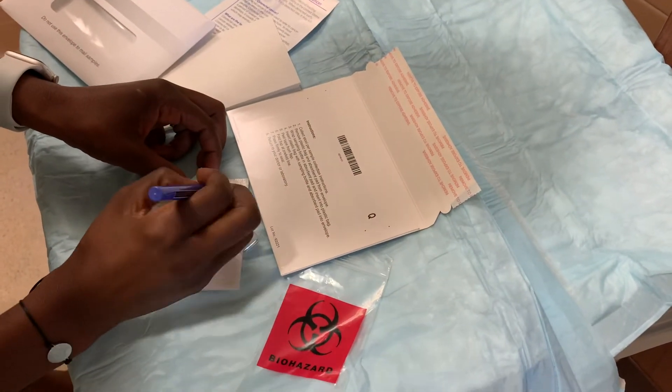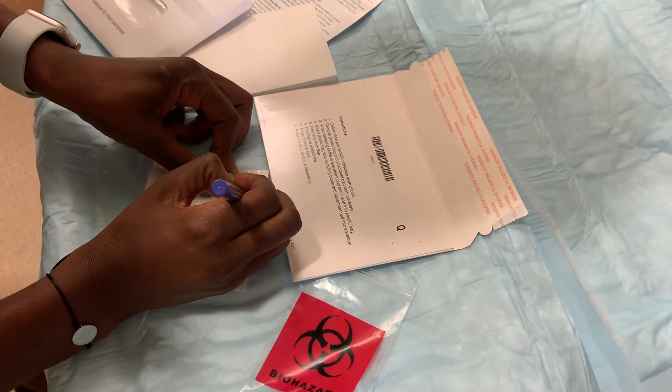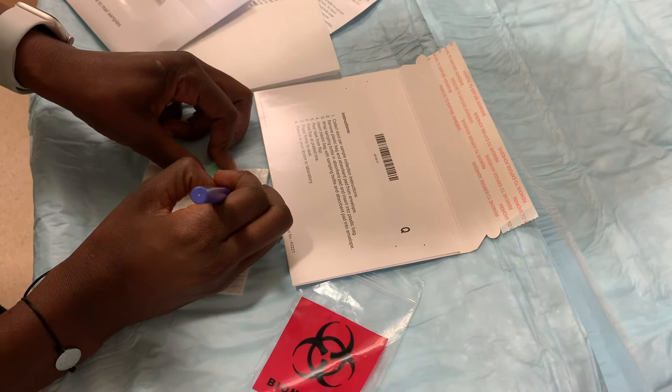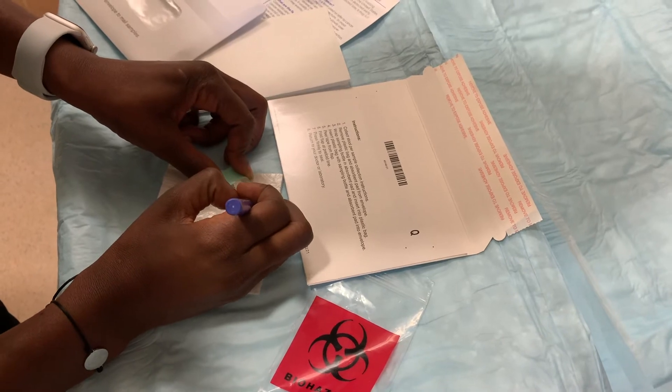Once you open the kit, you're going to write your name on it. Sau khi bạn đã mở ra và bạn phải viết tên của bạn lên cái dụng cụ thử phân. Your date of birth. Ngày sinh của bạn. And the date of collection. Và cái ngày bạn lấy mẫu thử.